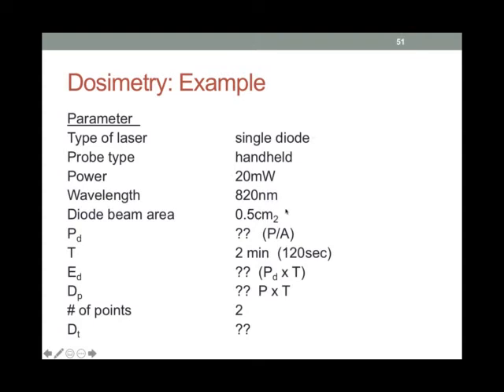So now we want to see how much energy we are going to put into our patient's lateral epicondyle, or towards the tissue covering the lateral epicondyle. So we're looking at what is the power density, right? That's the power per area. So what I'd like you to do now is take some time and work through it. Pause the video here, take your time, go back through the slides that we've just done and see if you can find the answers.